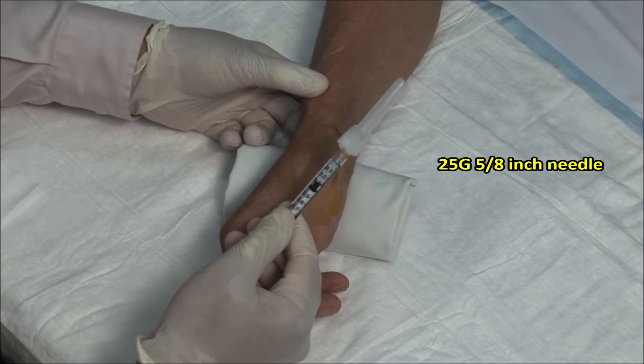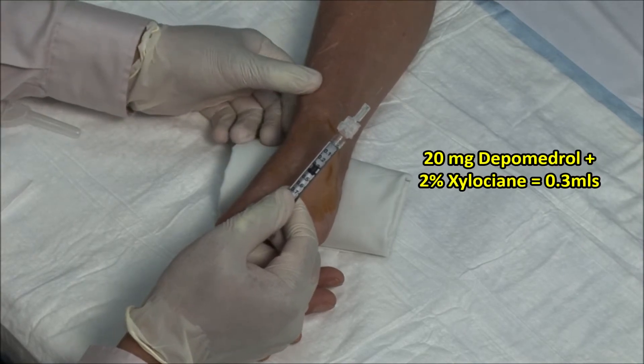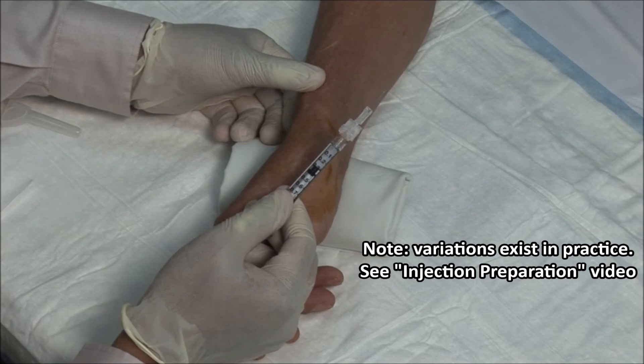I have a 1 ml syringe with a 25 gauge, 5/8 inch needle and a mixture of 20 mg of depomedrol and 2% xylocaine, with a total volume of 0.3 ml.